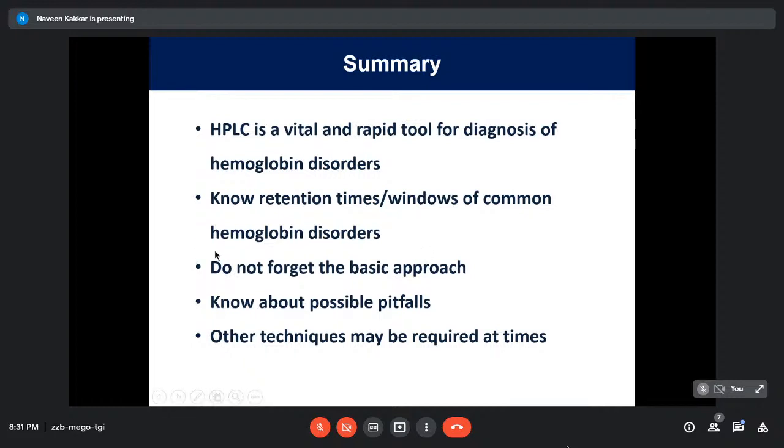Now, I give you 2 examples here, which are odd situations. We had a patient with the hemoglobin E trait from Punjab. Now, Punjab is not a belt for E. We kept on asking for history. Are the parents or grandparents from anywhere in the Northeast or Calcutta?